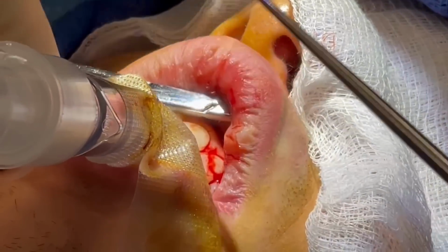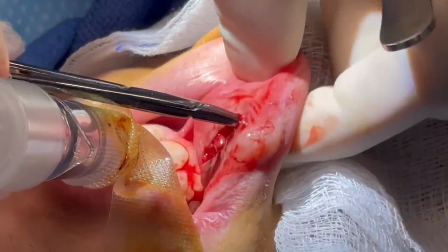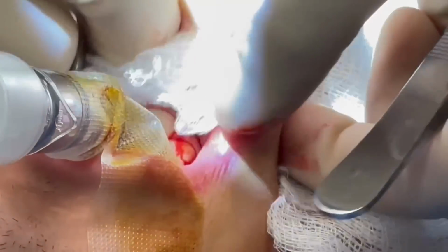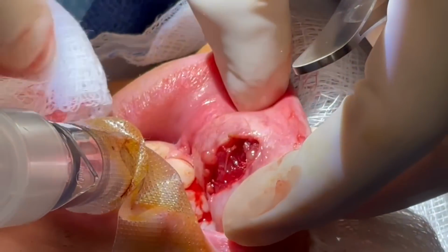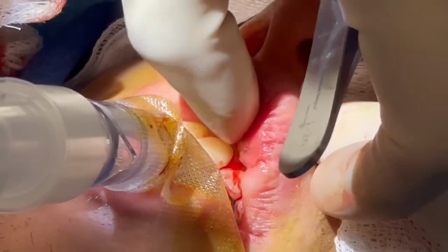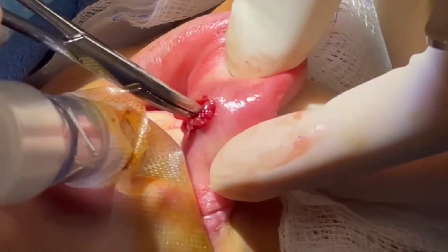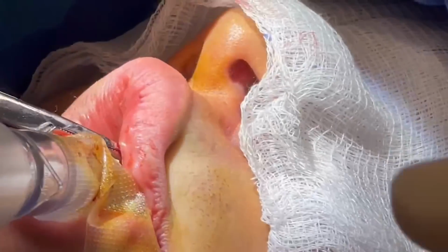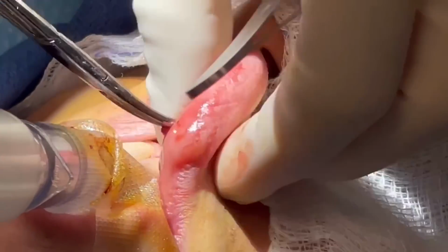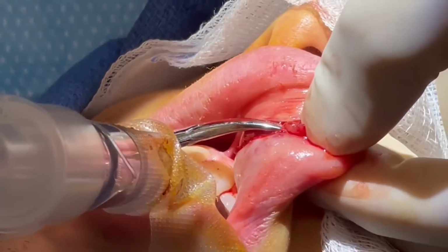Good, you can come out. Good. Good. Find scissors.